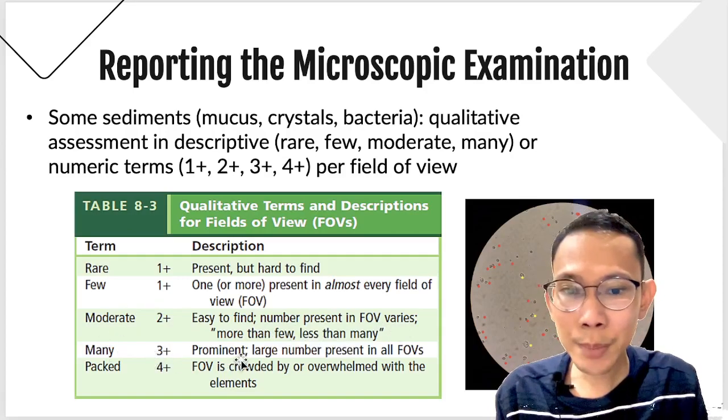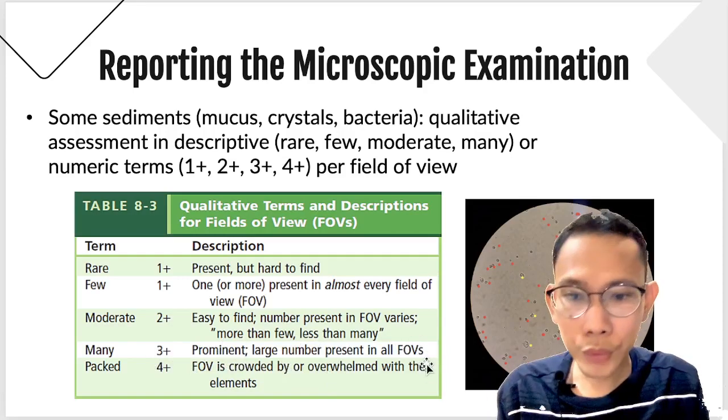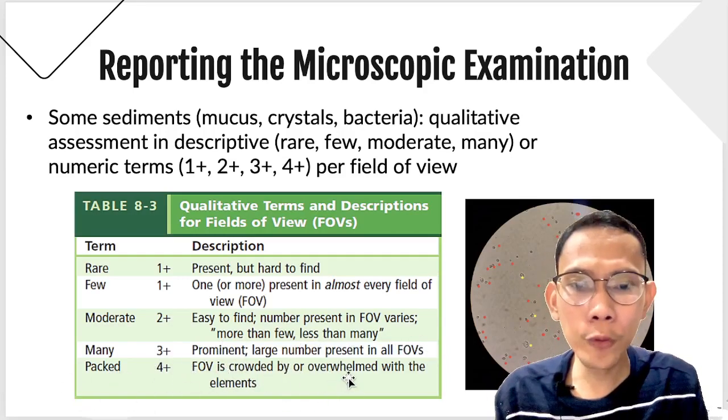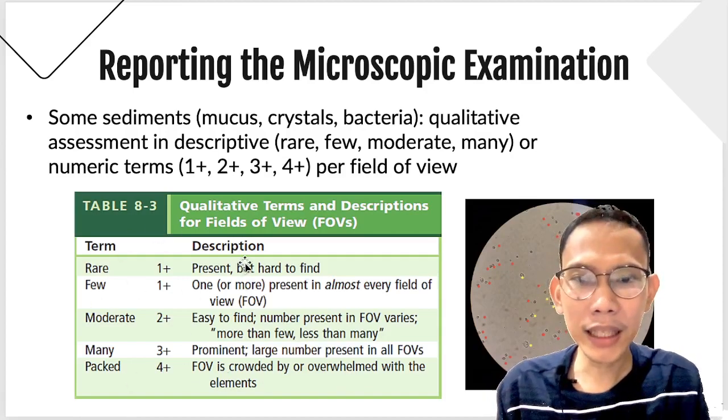Many, 3 plus: prominent, a large number present in all fields of view. Packed, 4 plus: the field of view is crowded and overwhelmed with the elements. So this is also now qualitative and descriptive.